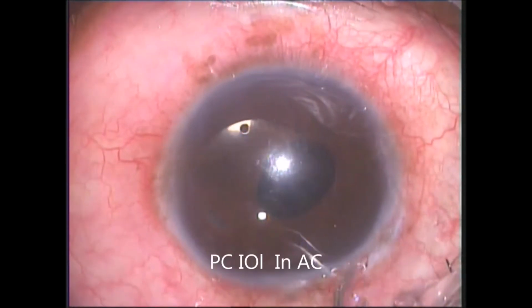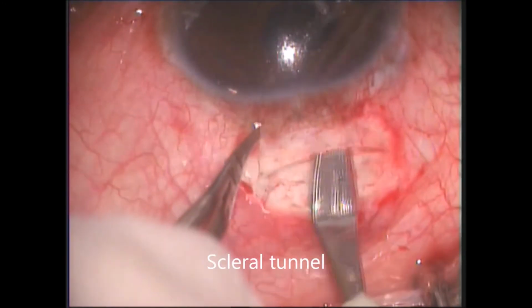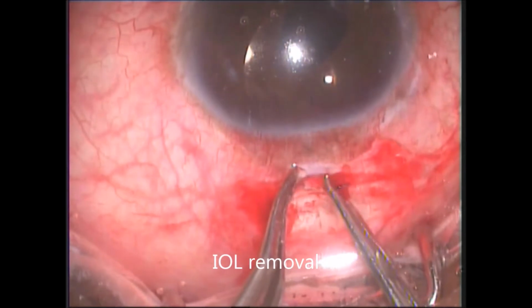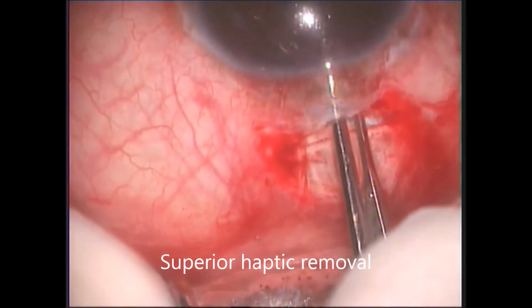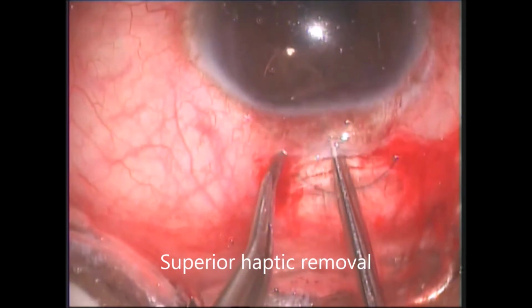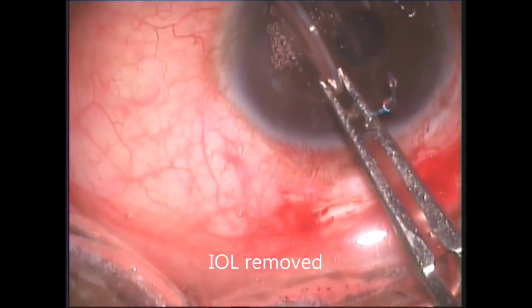In this case, a posterior chamber IOL was in the anterior chamber. So this PMMA lens was removed after making a scleral tunnel. This PMMA lens was causing corneal decompensation.